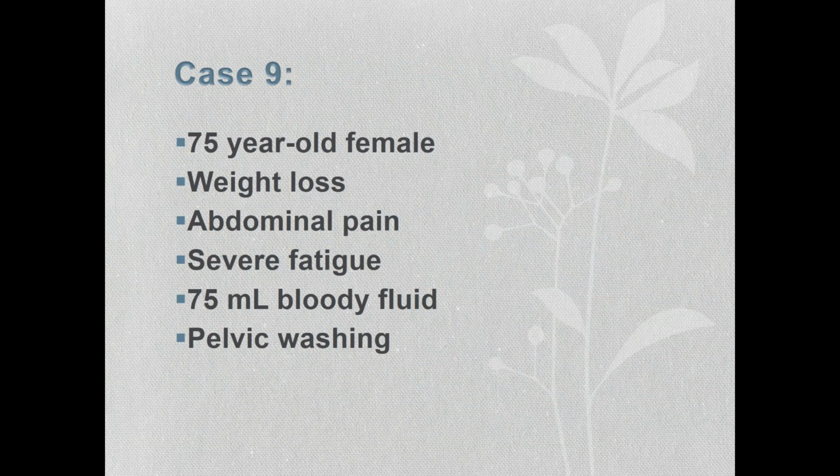Case number 9 is a 75-year-old female who was exhibiting weight loss, abdominal pain, and severe fatigue. We only got about 75 milliliters of bloody fluid in this. It's a pelvic washing sample. So I don't have any radiology for this, so I'm just going to go right to the glass and show you a couple of images.